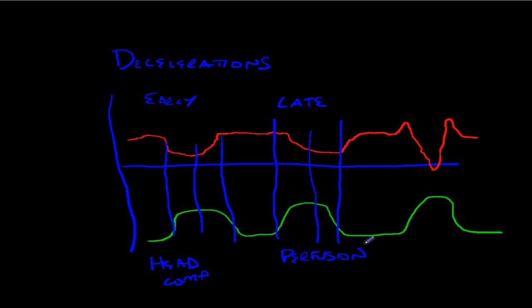And what we're seeing with this is a decrease in perfusion with a contraction. It's causing fetal hypoxemia, decreased PO2. That's causing the fetus to shunt blood to the brain. It's causing a vasoconstriction in the periphery. Blood pressure goes up. The vagal response to that is to decrease the heart rate to decrease the blood pressure. And again, in order to reverse that process, that's going to take time, which is why we see this lag here after the contractions let up.